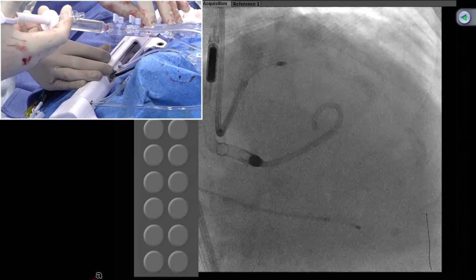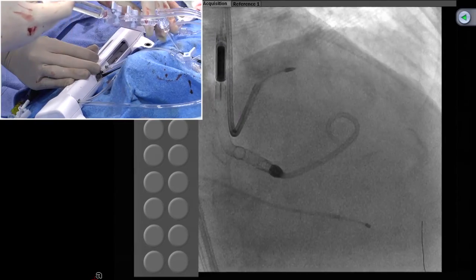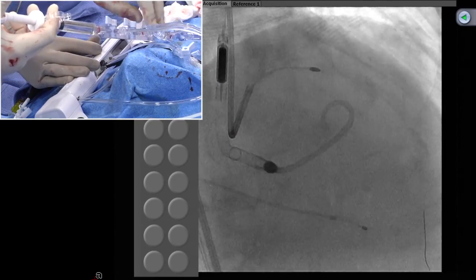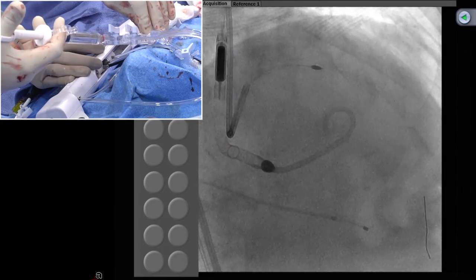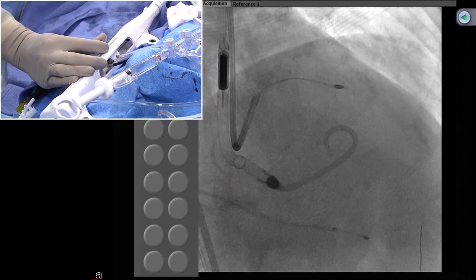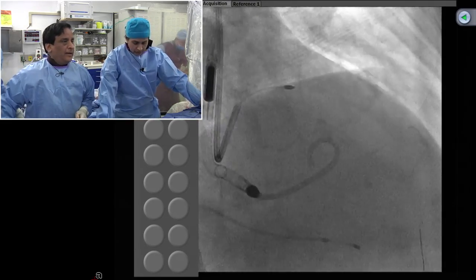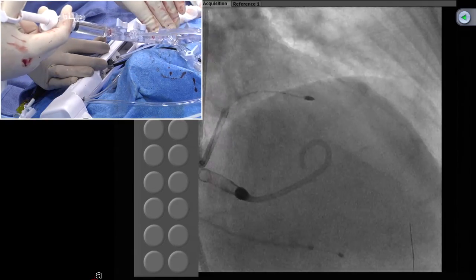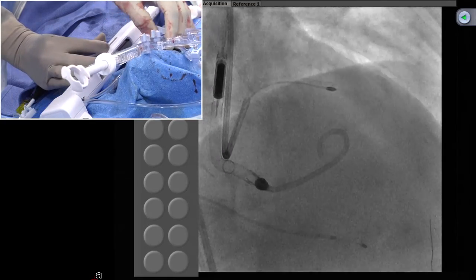Is this a temporary or permanent pacer? It's a temporary pacer. Many of these complex left main cases — we do leave the temporary pacemaker in. She originally in November when she had a cath apparently developed heart block, so that's why. She never required a permanent pacemaker. In complex left main cases, we know the temporary pacemaker will fire in probably less than 10% of cases. Every burst is every time here — 20 seconds — we just stop it. Slow pecking motion, go backward-forward.